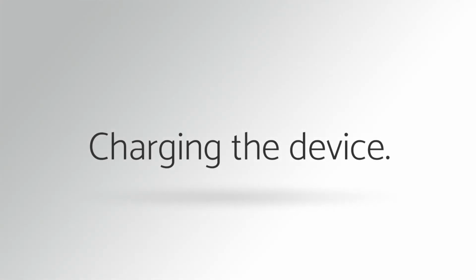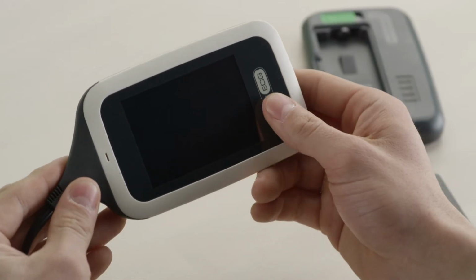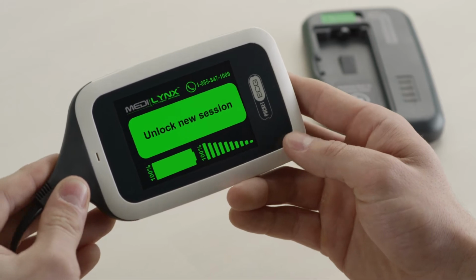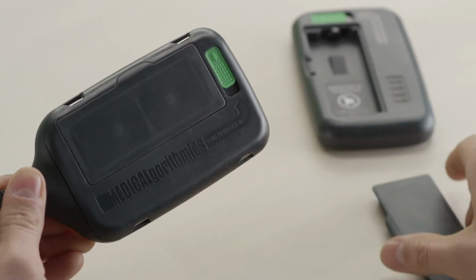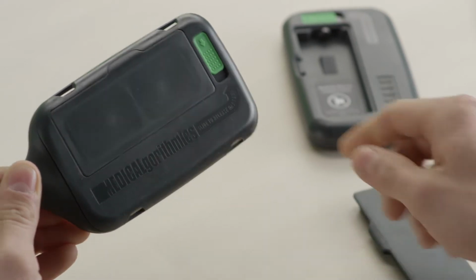Charging the device. For your pocket ECG to work properly, it's important that these batteries are charged on a regular basis. Your pocket ECG comes with two batteries for your convenience.